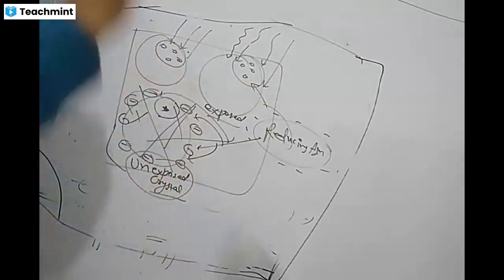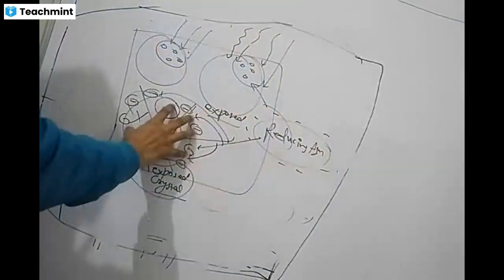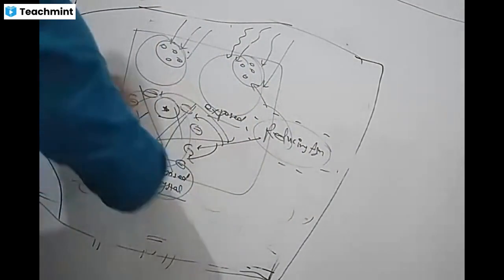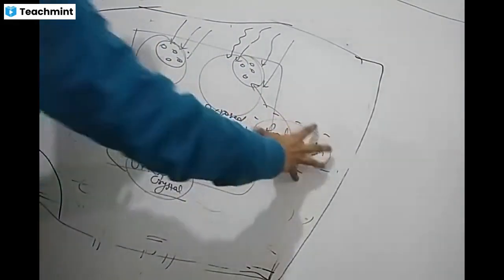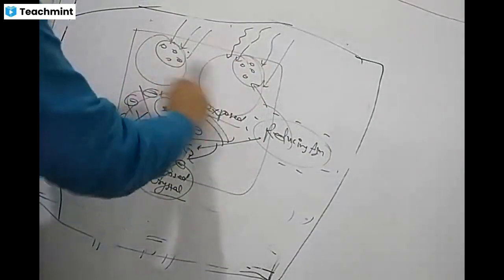Its whole surface is negative. Our reducing agent also has a lot of electrons, a negative surface. It cannot come and reduce it, so it will remain as such. The fixer will come and remove it from the emulsion. So the role of the reducing agent is only to reduce these two, meaning the exposed crystals.